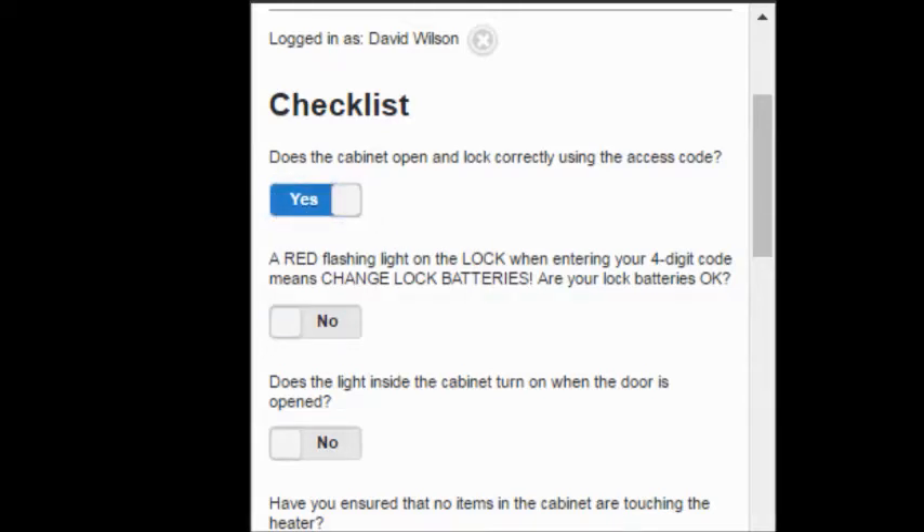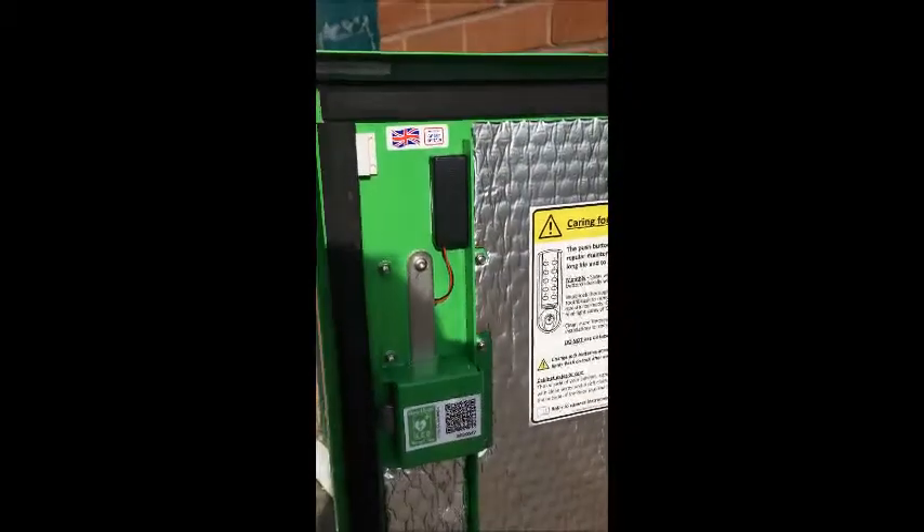We were looking for a red flashing light on the lock when we entered our access code, as this would mean the batteries needed to be changed. We didn't see it, so we know the lock batteries are okay and we can answer this question by sliding it to yes.